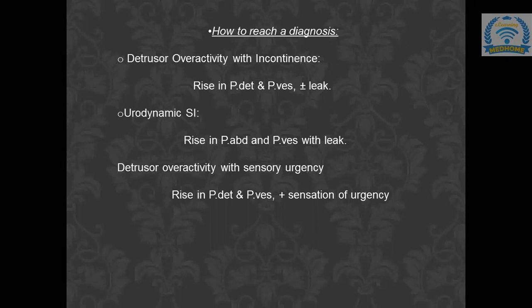It depends. Capacity will be reduced with it. Yes, capacity will be reduced, but for detrusor overactivity, there may be a leak or there may not be a leak.